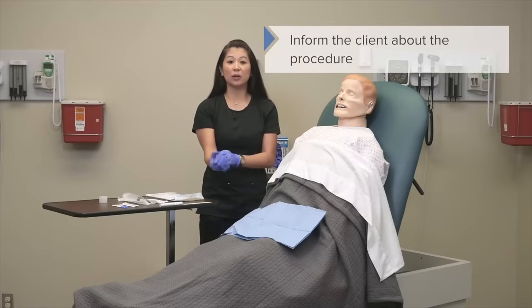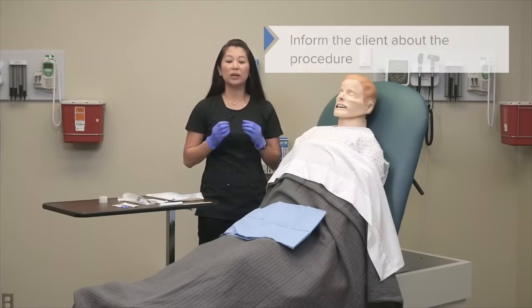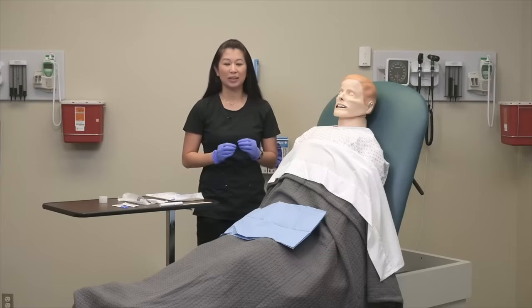At this point, I've already explained the procedure to my patient. I also let them know that when you insert a nasogastric tube, it is not the most comfortable procedure. So be really honest about this when you're approaching your client about it.